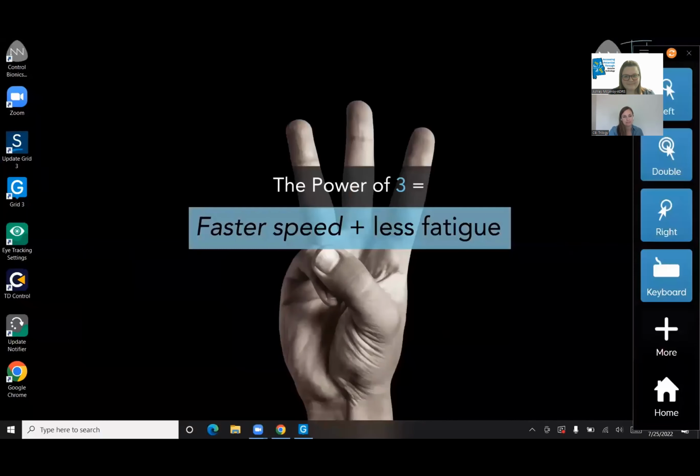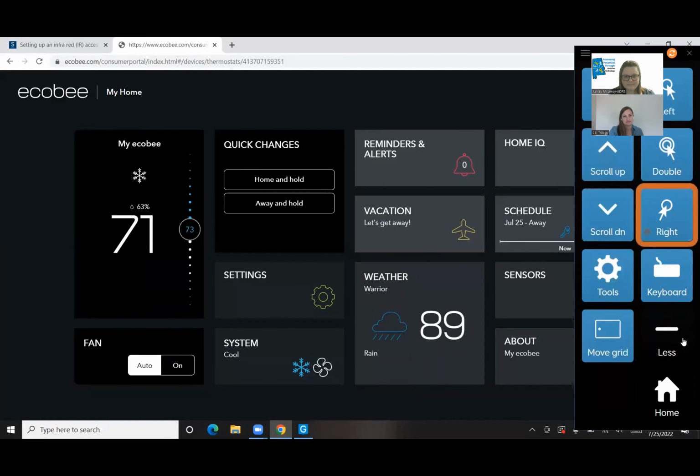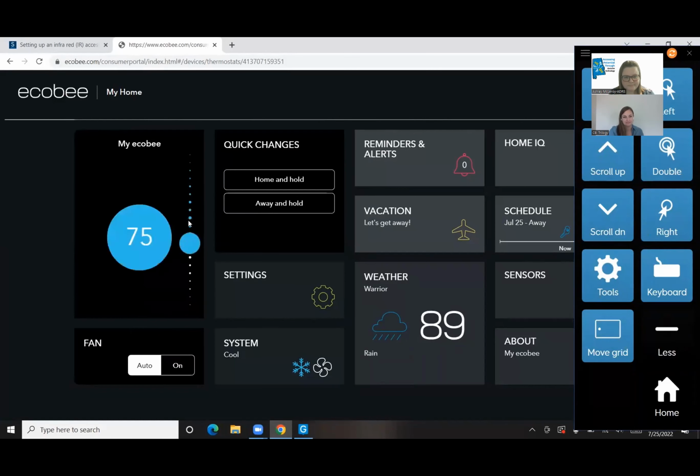So if I go back to Fast Talker and select computer control, it's now going to give me mouse controls on the right hand side of my screen that will allow me to access everything on my computer. So if I pull up Google Chrome, I can access the web page and all the controls, including the temperature slider bar. If I click more on my mouse controls and select drag, just be sure to favorite or pin the tab for the web app so it's easier for your user to locate.